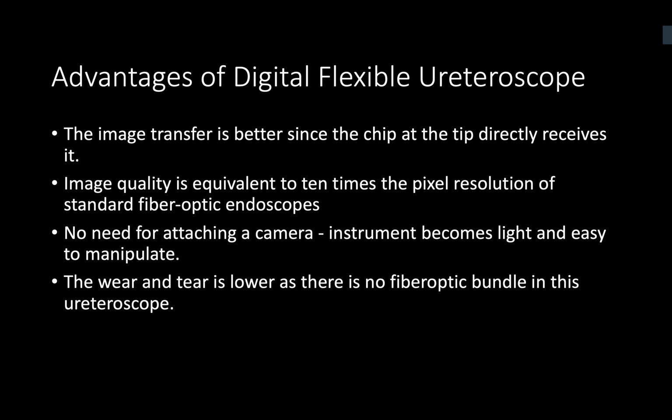Coming to the advantages, what are the advantages of digital ureteroscope compared to the conventional fiber optic ureteroscope? So a digital scope is disposable and does not require sterilizing. In my experience, it doesn't require attachment to a separate camera head. Therefore, there is less rotation and twisting during the procedure.